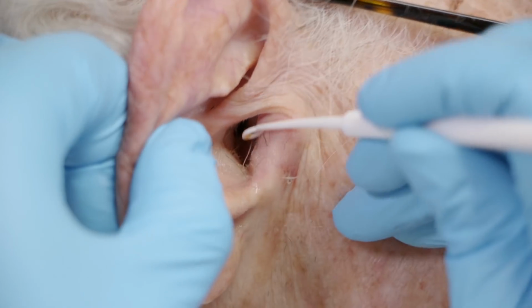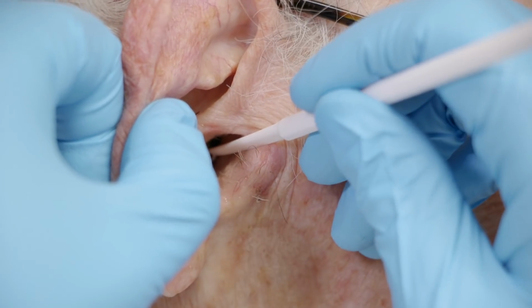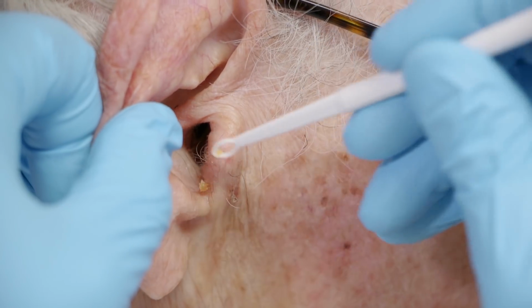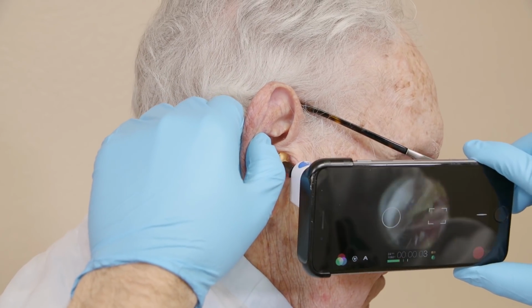Let's see if we can. And it's hurting. But I got it. You got it? Yeah. Was it really hard? It wasn't a lot, it was just this. Some curettage, you can still see. It's not especially hard, it's just, you gotta grab it.